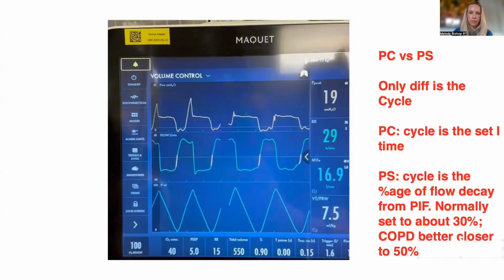Which brings up the next point, which I guess we might as well, what the hell, we might as well do it. SIMV, right? Let's say SIMV PC, what is really the difference? There is no difference, right? Because the spontaneous breaths are handled as pressure support. The control breaths are pressure control. As you mentioned, the only real difference is the cycling mechanism, right?